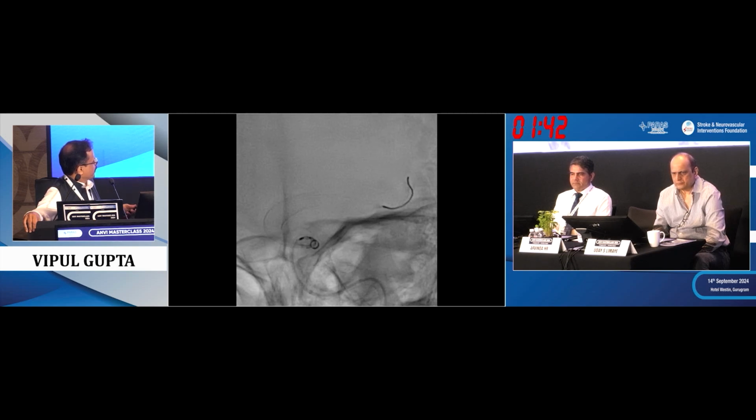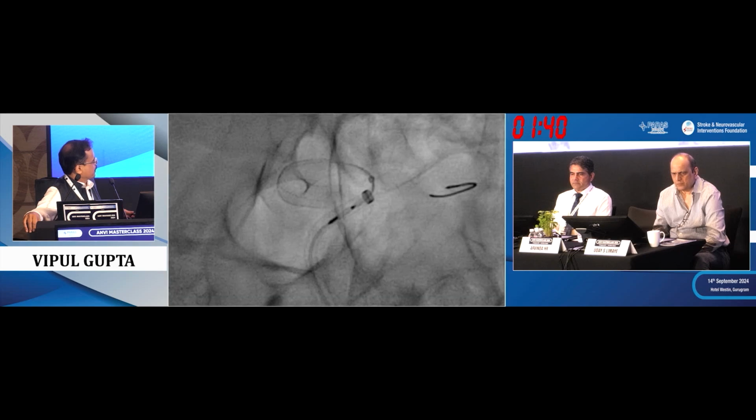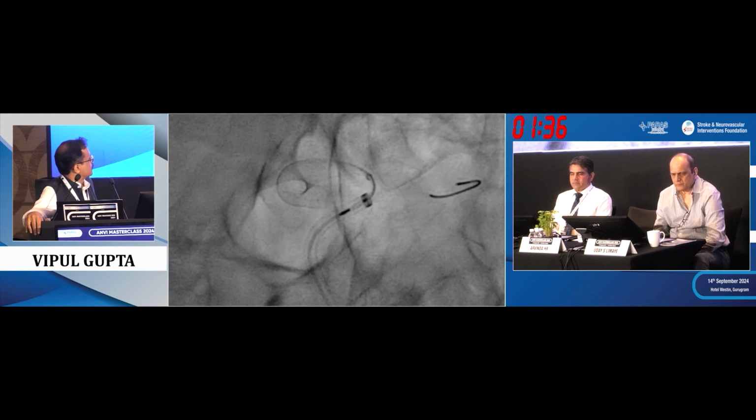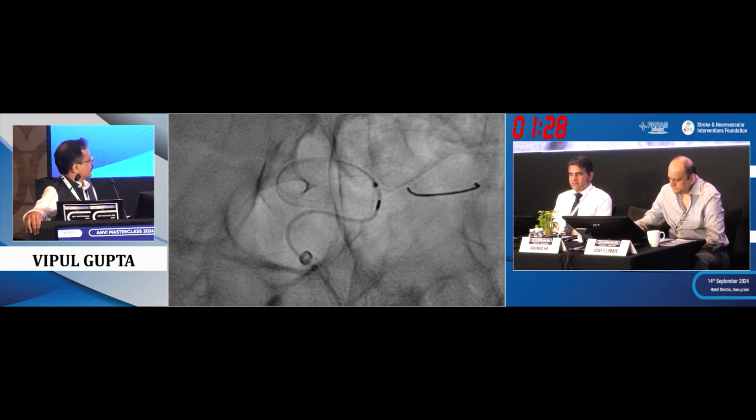So we do all our manipulations. So you can see I love this dark line. I know then in this region I've really compacted the flow diverter a bit. And once you deliver the lower end, very frequently, this being a Pipeline device, it doesn't open, then you can use the microcatheter to open it up. It's usually not a major issue.